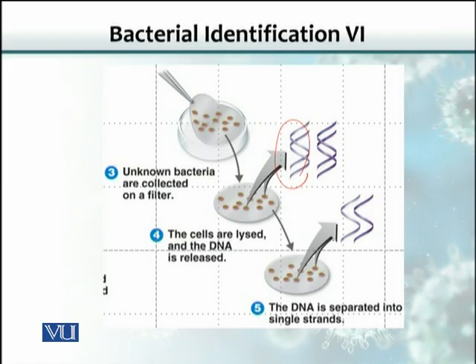And then we would give a treatment. We would also put this filter into a heated compartment, an oven called a hybridization oven, where we increase the temperature, and also we put some chemicals in order to denature the double-stranded DNA into single-stranded DNA. And then we would put our probe also. If the colonies are specific to Salmonella, the probe which we would add here would bind to this specific DNA fragment there.